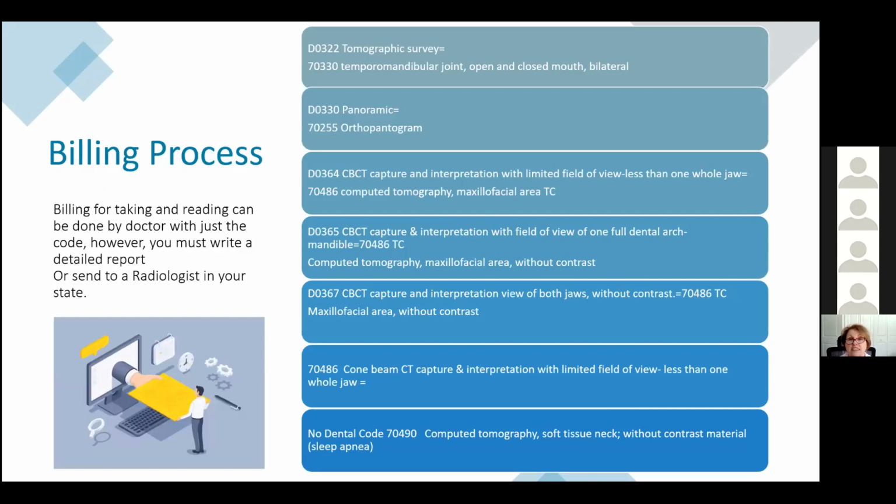The billing process, you can see I've converted the codes from dental to medical and how you are able to bill for it. But I just want to show you here the dental code, this capture and interpretation with field of view of one dental arch in the mandible. Actually, the TC component is for the capture, not the interpretation.